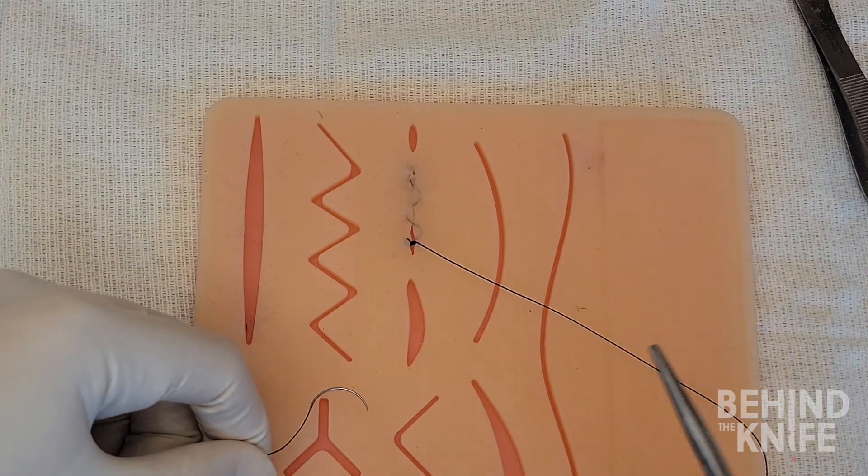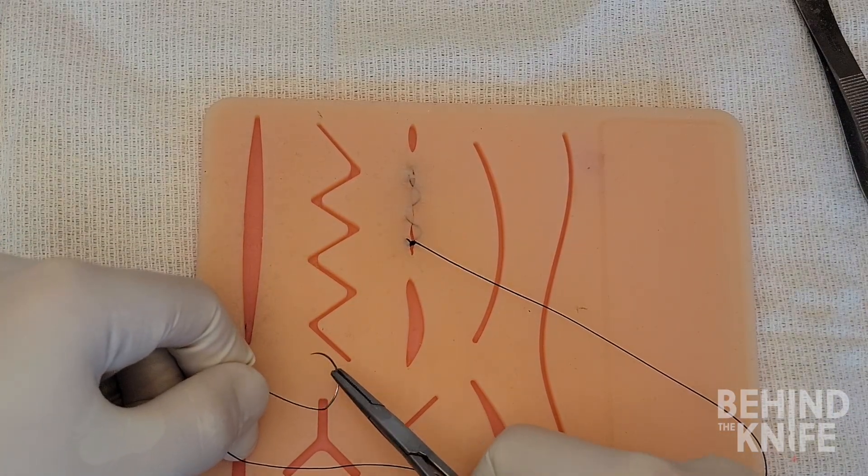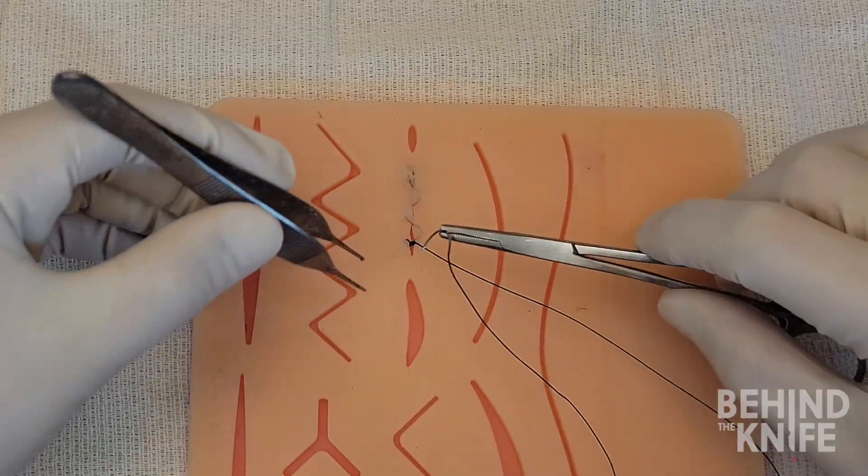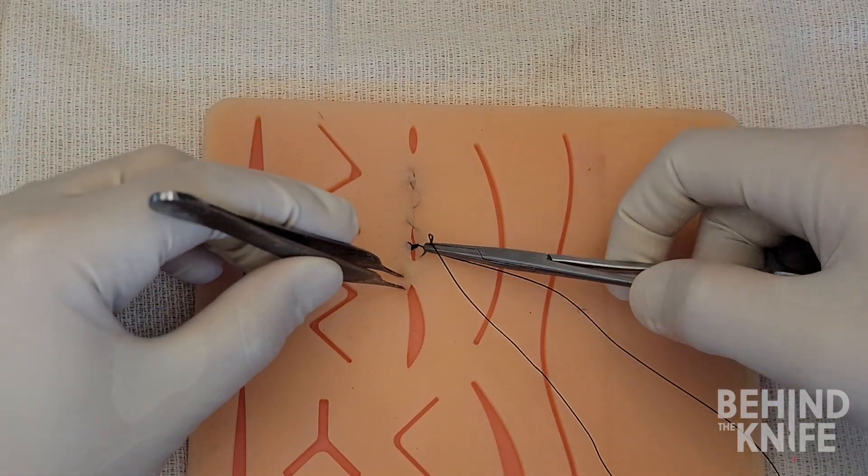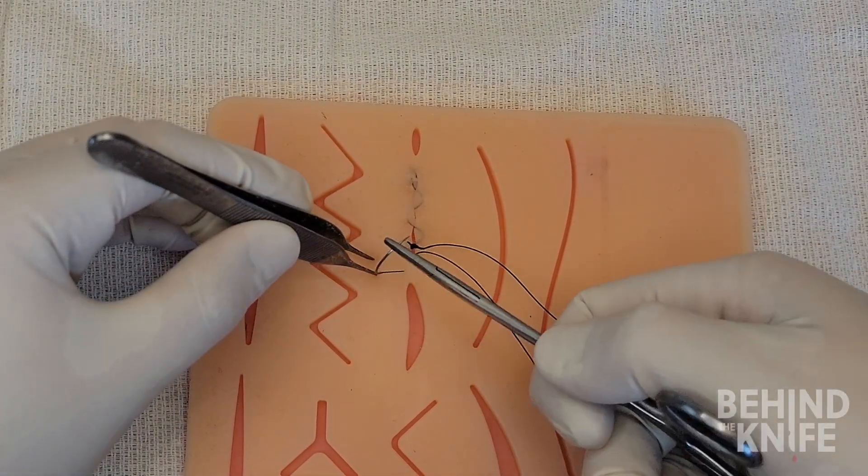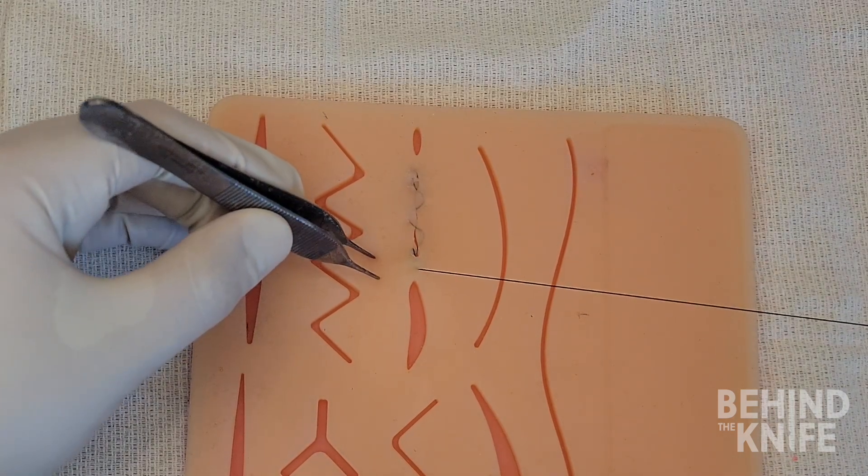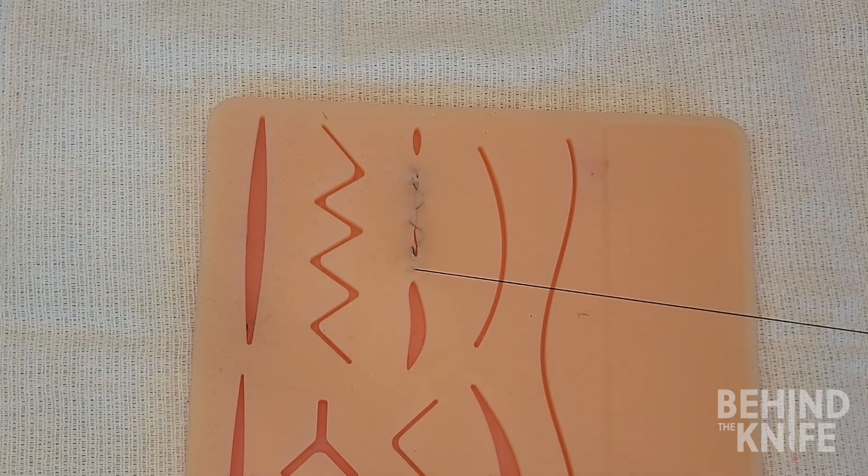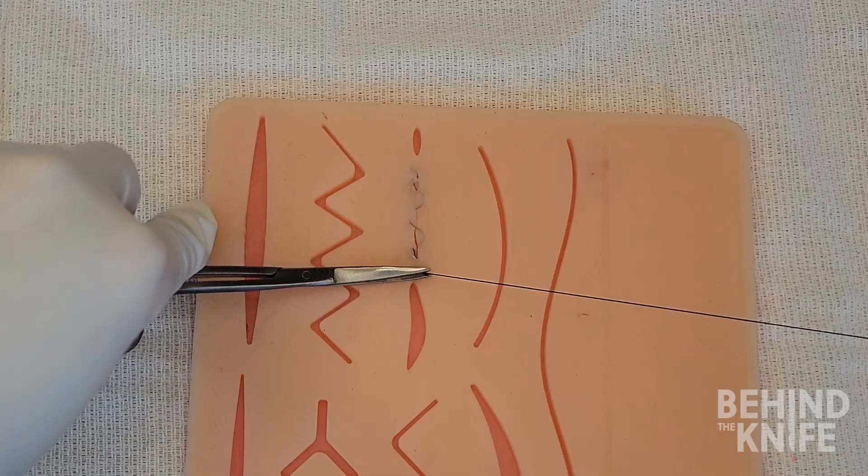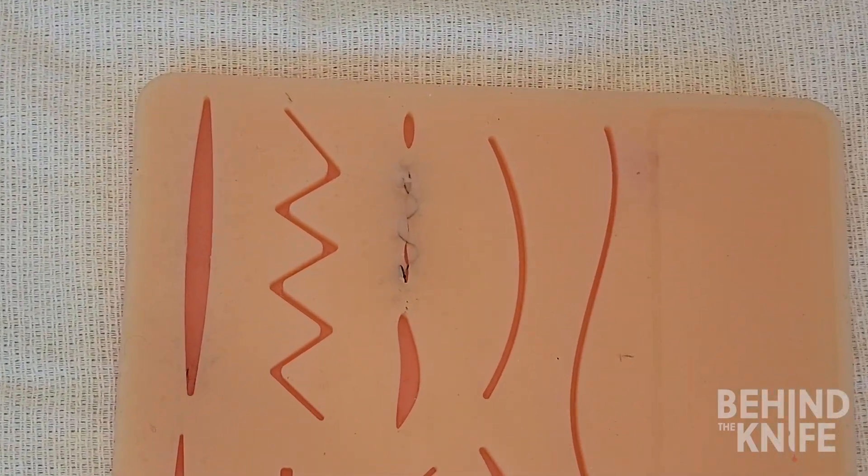Now from here, we can re-grasp the suture with our needle drivers and take a bite at the bottom apex of the wound to bury the knot we've just tied. Once you cut your suture flush against the skin, you've just completed a subcuticular running suture.